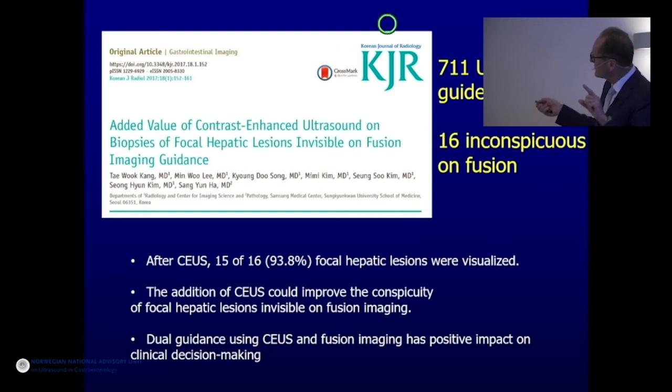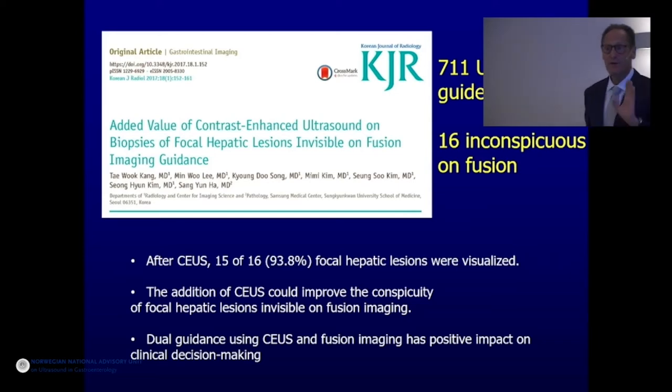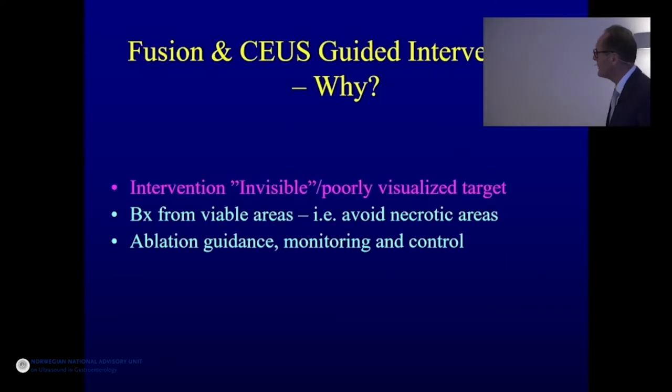Now, because they had fusion with CEUS, they were able to see 15 of these 16, and they could take a biopsy and get to a conclusion. So the added value of fusion and CEUS is invaluable. It's a very, very good tool for difficult cases.